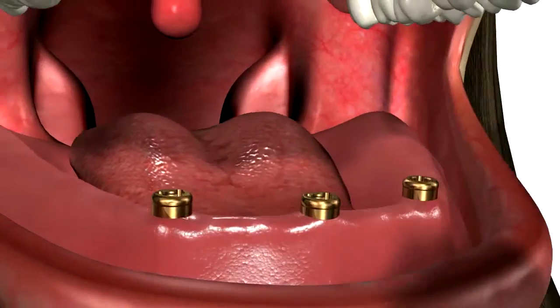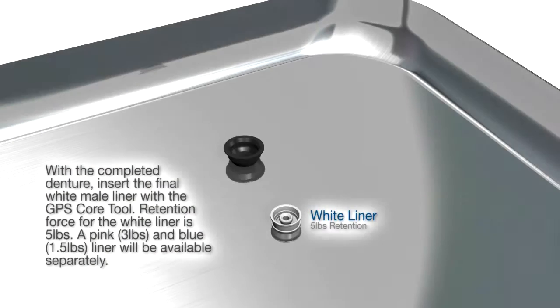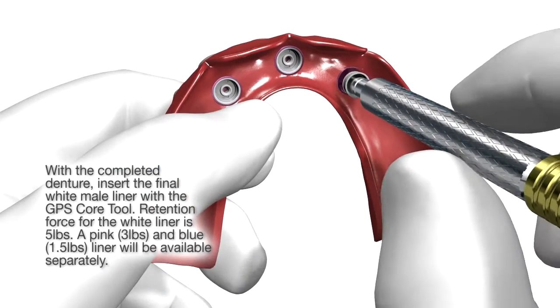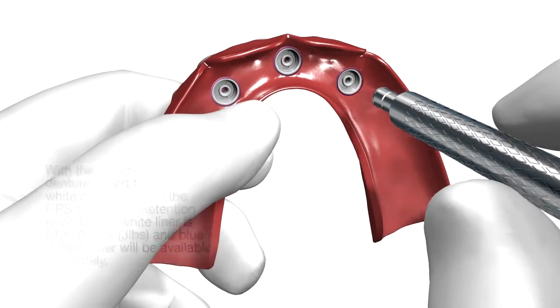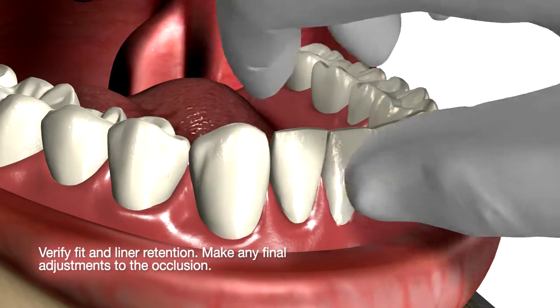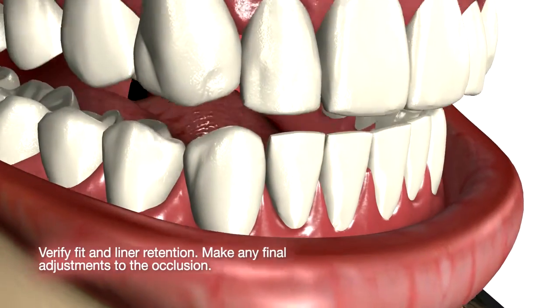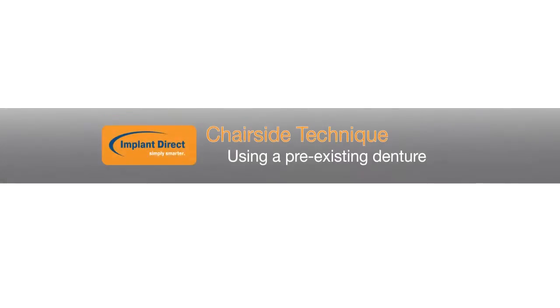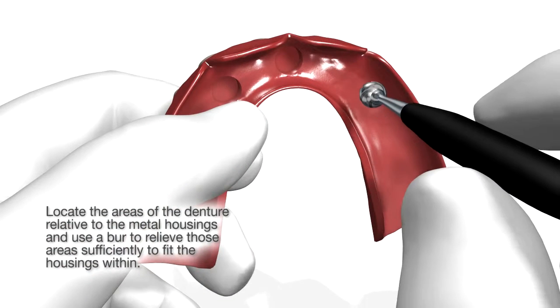Process the denture, and then you can remove the black insert and pop in the final one. Check the occlusion. You can also do this chair side using the patient's existing denture. Create space for the attachments.